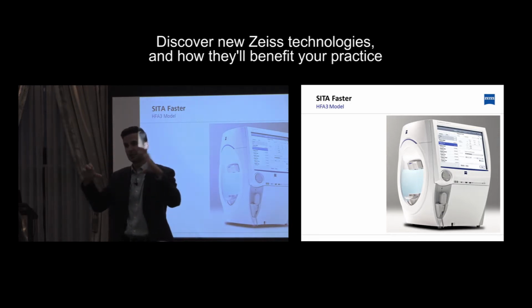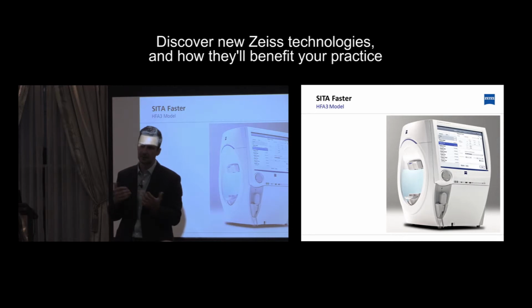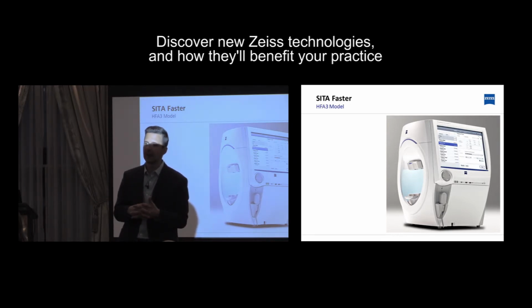Now, you could take them and widen them out. There is some maneuverability within the device, and then take two larger images, top and bottom, but then you're into 4 images. What we found with the dilated pupil was it just sped up testing time. You were consistently at 2 minutes or less with testing time, and I think we would have gotten faster than that. But that was our initial workflow in having it on a limited basis to really run the trial.